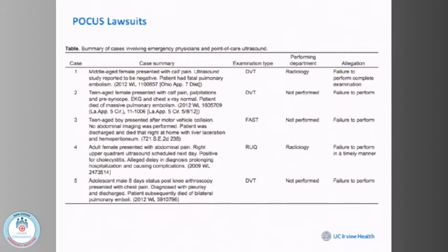On the rule out: if I think this patient is very low likelihood of a DVT, I can find other reasons while I'm looking for DVT. Oh, I find cellulitis, and I find a large lymph node. That's why their leg is swollen. Then I'm done. I don't get one from radiology. It doesn't make sense to me at that point because my whole gestalt has changed. I found a reason for them to have a swollen leg. But just keep that in mind.